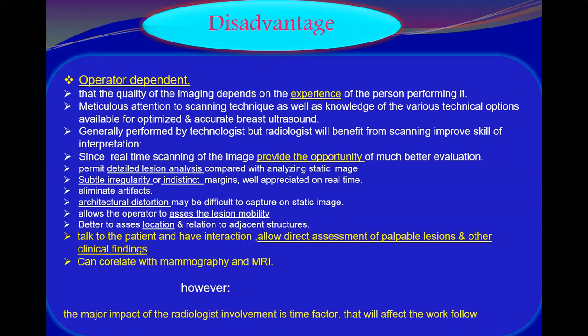It will definitely be well appreciated in real time, unlike a static one. It will eliminate the artifact, as you have seen. Subtle architectural distortion, you will see definitely in real time. You might not appreciate it on a static image.